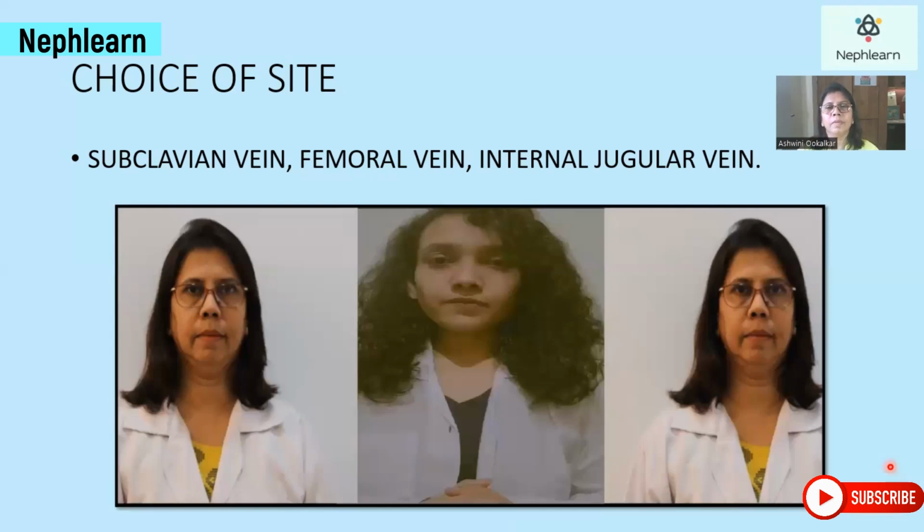The second site, that is the femoral vein, is again very convenient to do. But if the patient has a femoral vein catheter, it is recommended that he be bedridden, and therefore beyond the ICU, the patient cannot have a femoral vein catheter while walking home.